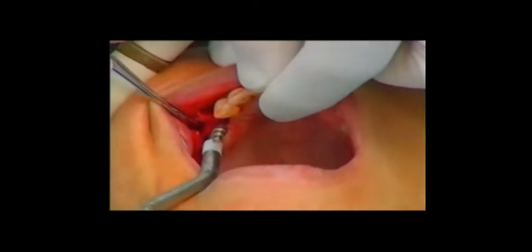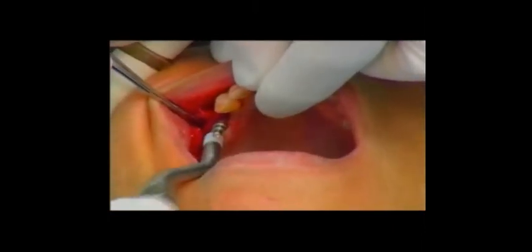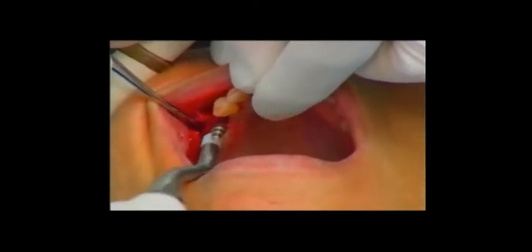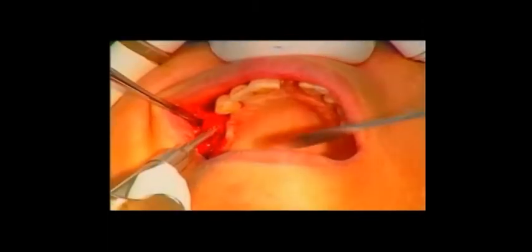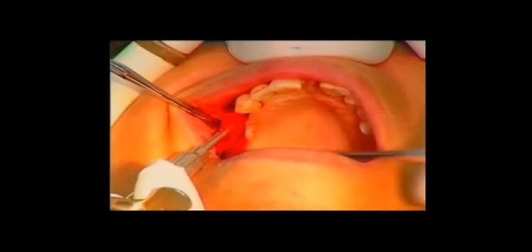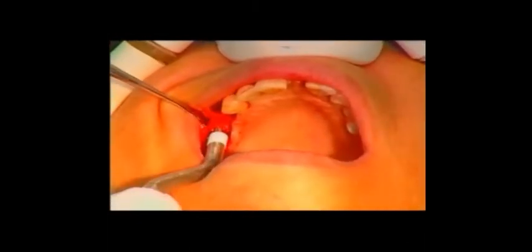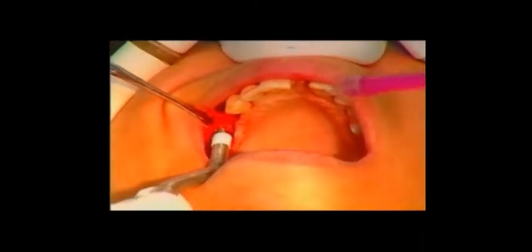The osteotomy is widened from 2 millimeters to 2.9 millimeters using the Miami osteotome. Bone substitute is injected into the osteotomy with a dedicated bone graft injector. After controlled fracturing of the sinus floor, a periapical radiograph is obtained to verify the length of penetration of the osteotome into the sinus.